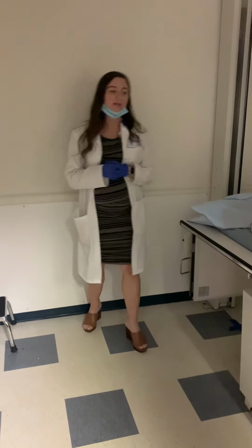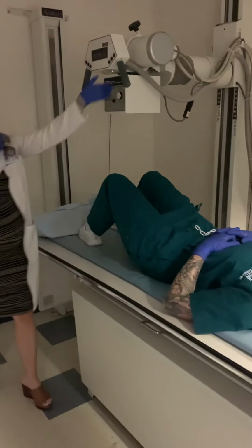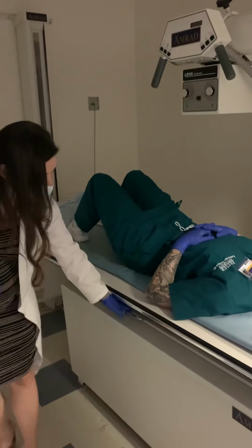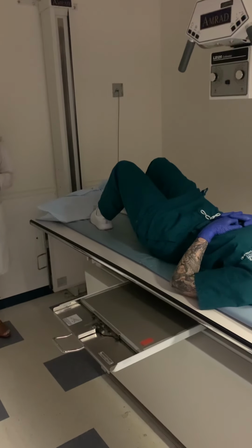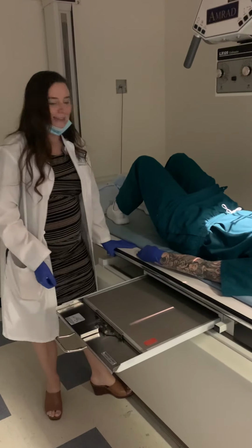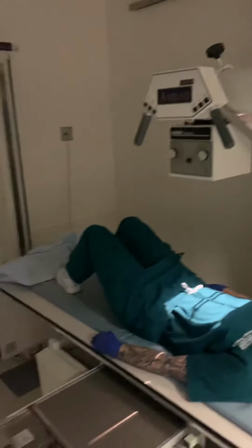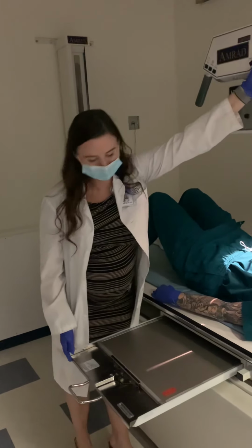So all of that has been done, the doctor left, and now we're gonna get her into position. She's already in a gown, she's full of barium, she's ready to go. So our IR size for all of these is gonna be a 14 by 17. So have it in here, 14 by 17. But your actual collimation is 11 by 14. So what does that mean? We're gonna modify this. It's already modified from before. So 11 by 14, it's gonna look kind of skinny like this, as if you're messing up your kV or something. So 11 by 14.